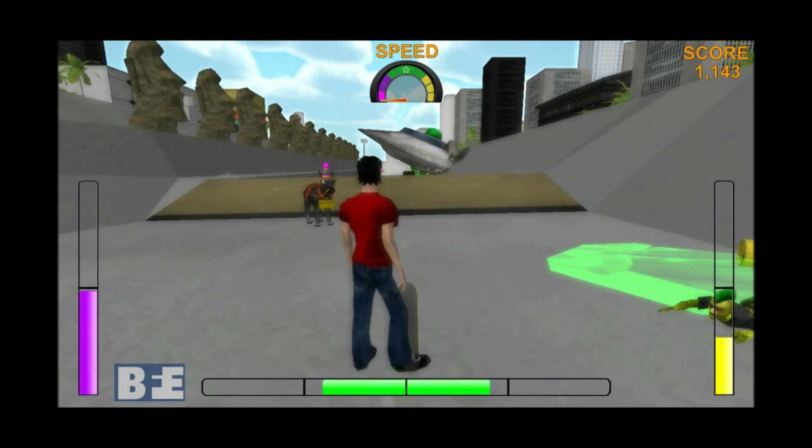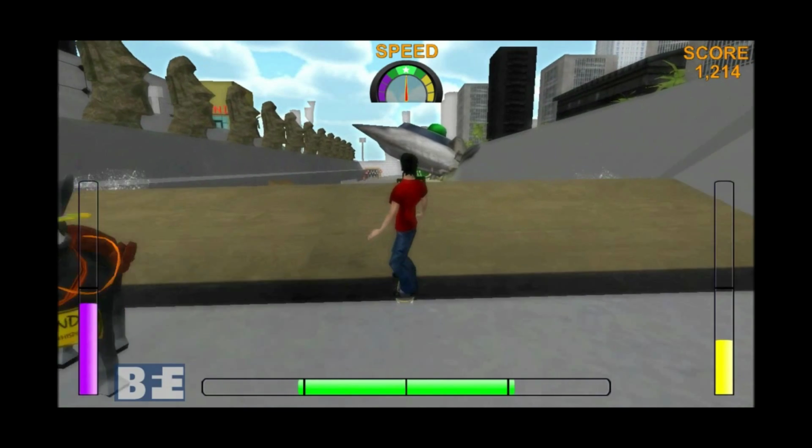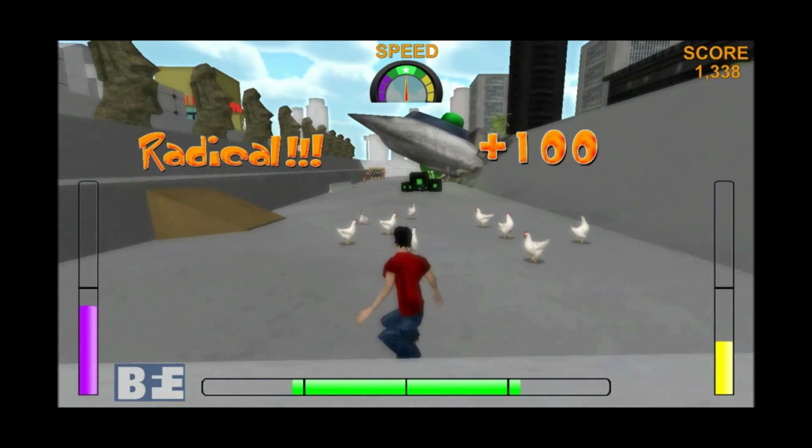Now, as the client continues to self-regulate a little bit better, we can see the green bar graph is slowly growing. It's going to cross that black threshold, and there we go. The skateboarding character begins again and continues to move.